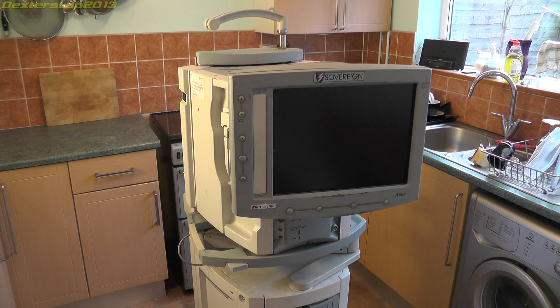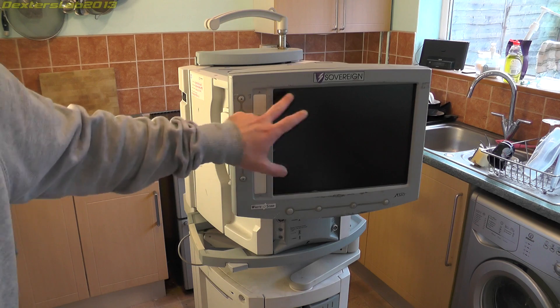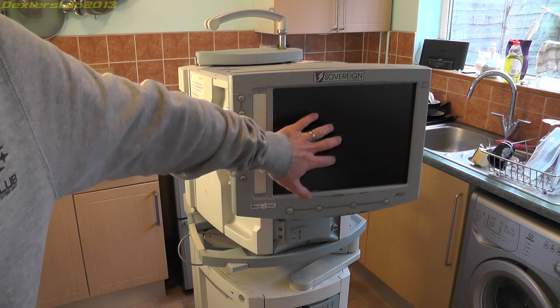Unfortunately, I got the guy to bring it round to my house because I probably wouldn't have been able to fit it in the car. And unfortunately he dropped it off the back of his van, so it doesn't work anymore. It fell on its screen, smashed it completely — there was actually a glass screen in here and the LCD has been busted as well.